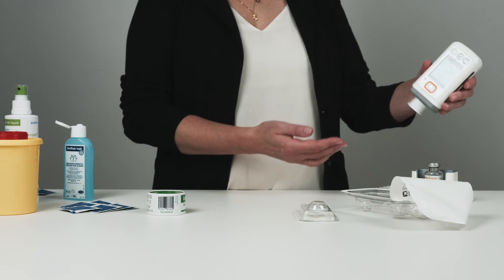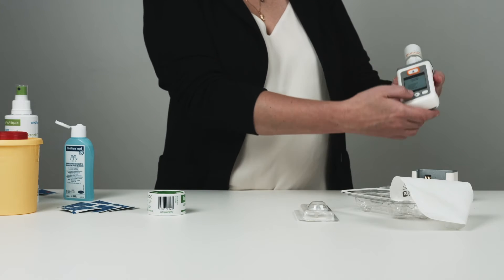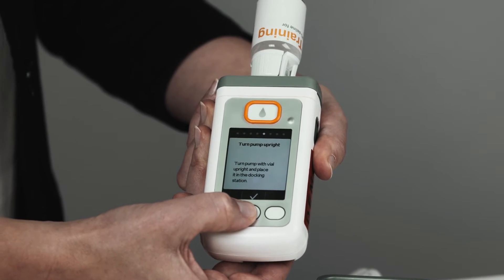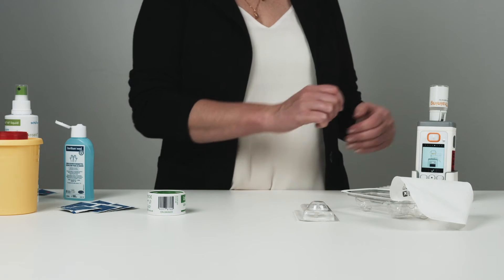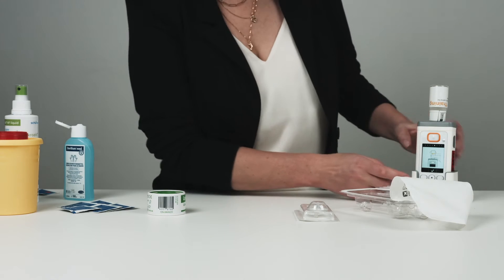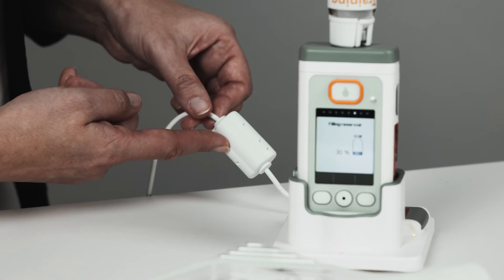Turn the pump upside down and attach the pump adapter to the top of the vial. Then turn the pump upright and place it in the docking station. Confirm this step by pressing the button. Tighten the adapter by turning it clockwise and start the filling process by pressing the checkmark button.